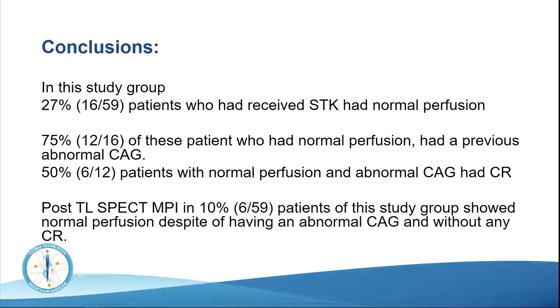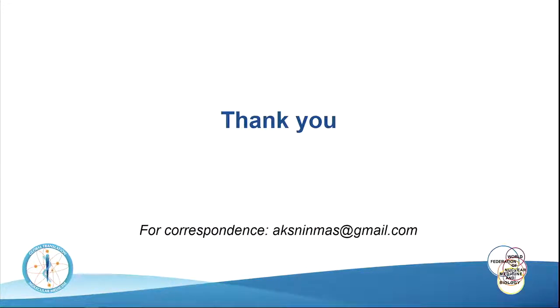So in conclusion, in this study group, 16 of 59 patients, which was 27%, who had received streptokinase had normal perfusion. 75% of patients, that is 12 of 16, who had normal perfusion had a previous abnormal coronary angiogram. And 6 patients out of 12 who had normal perfusion had an abnormal coronary angiography, actually had undergone coronary revascularization. So post-thrombolytic SPECT MPI revealed normal perfusion despite having an abnormal coronary angiogram and without any coronary revascularization in 6 patients. So that was all. Thank you.